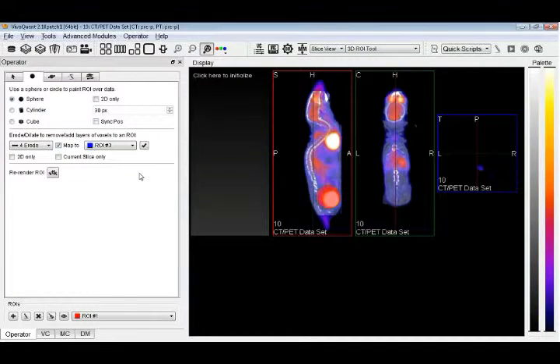Can you explain the erosion? Oh, erosion and dilation are a computational way in image processing of taking a shape and then adding a certain thickness to the edge, or decreasing the thickness in a certain way. So for a sphere, it's just adding a concentric sphere onto it. And here you can see the blue piece is a little bit thicker this time around, so you can see how that would work.